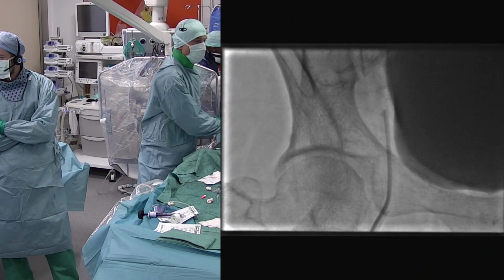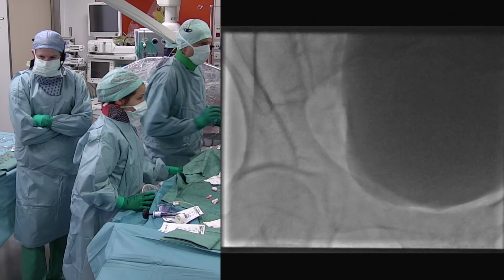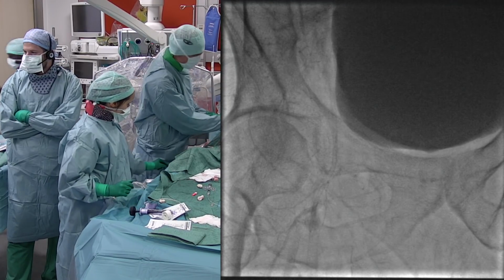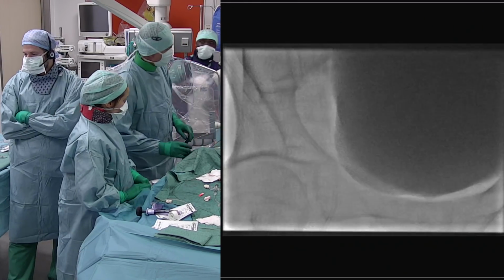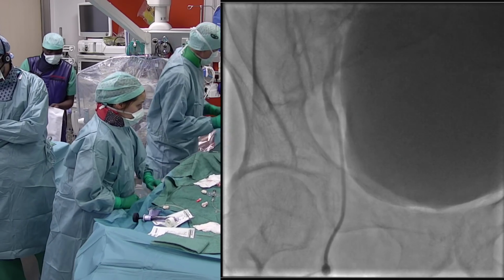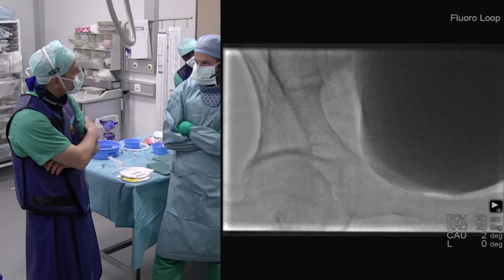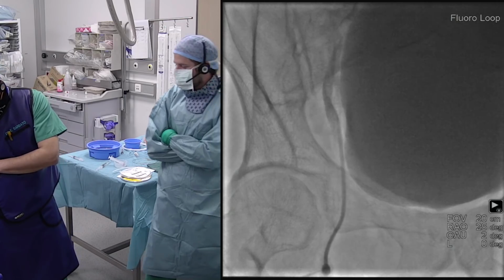Then a couple of questions pertaining to the concern of using OCT in diseased left main where the ostium is also involved. I think indeed there is a consensus in that case that OCT might not be optimal when ostial left main disease is involved. And next is about IVUS. Do you think IVUS could be a better choice for left main evaluation? Well, in IVUS you don't need to take care about good flushing.